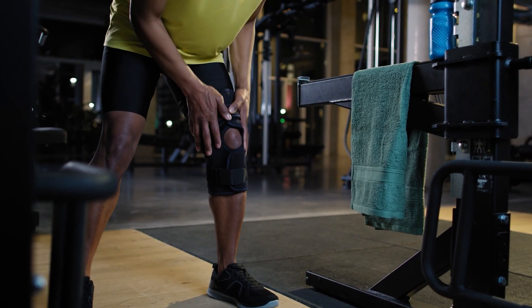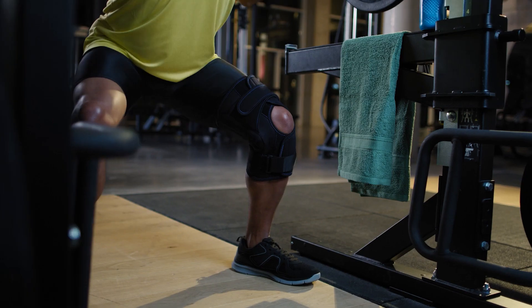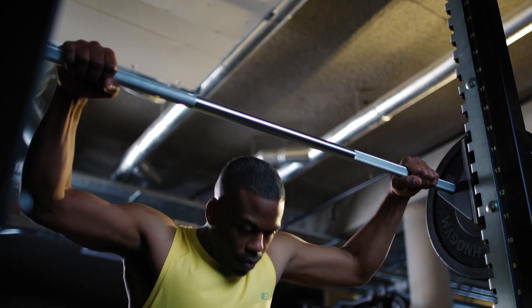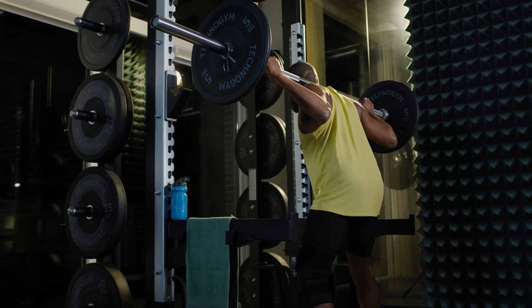It's from an old snowboarding injury. I ruptured both ligaments, needed surgery, and my doctor recommended this knee brace from the medical team at Actimove. These hinges on the side keep the knee steady and stable so I can be steady and stable in my workout.